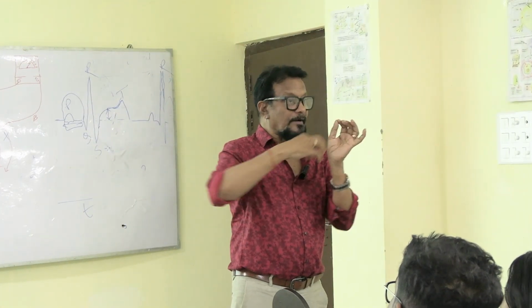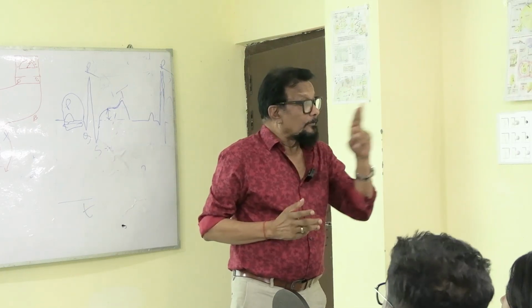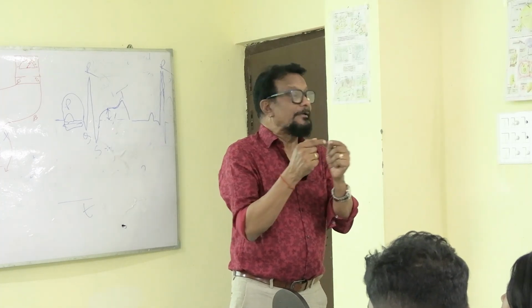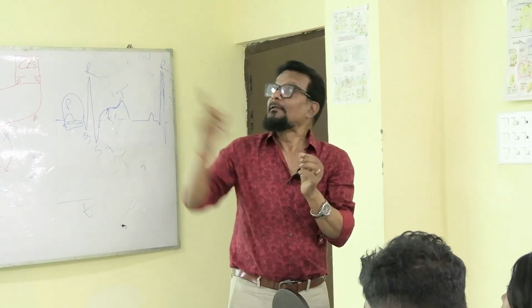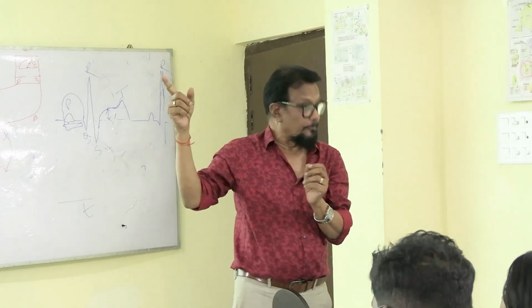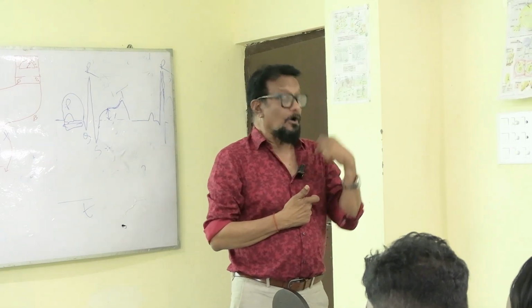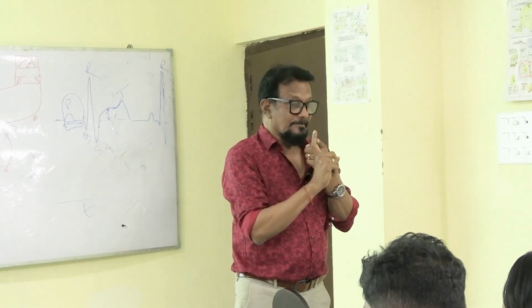These are different pathways. Whether any blockage is there, blockage means a discontinuity, like this wire may have a discontinuity. If the fan is moving and there is a discontinuation, will the fan move? No.